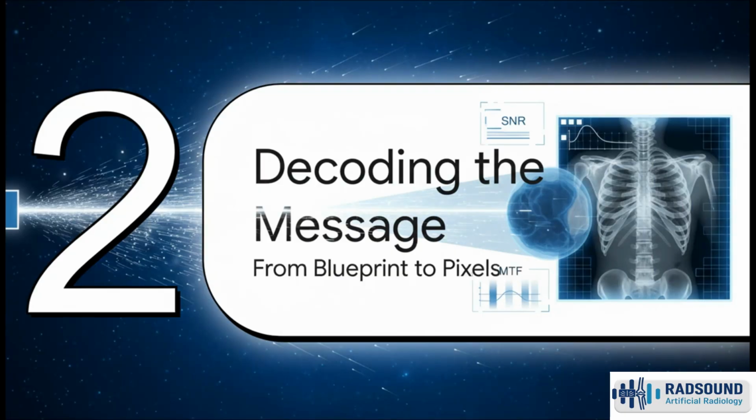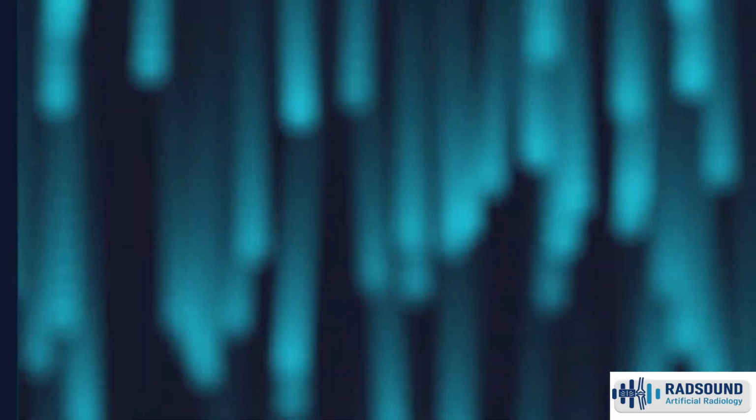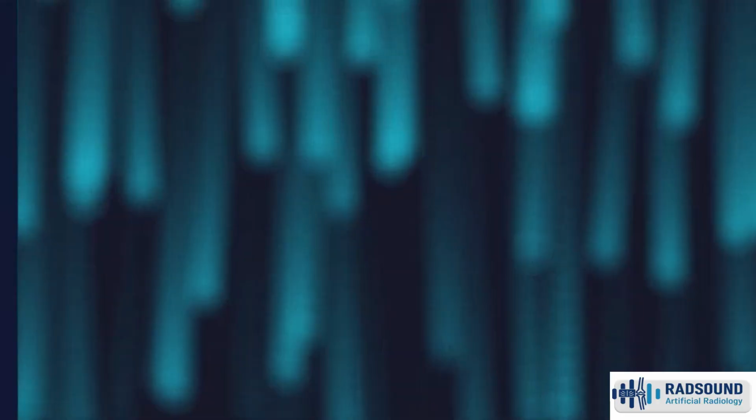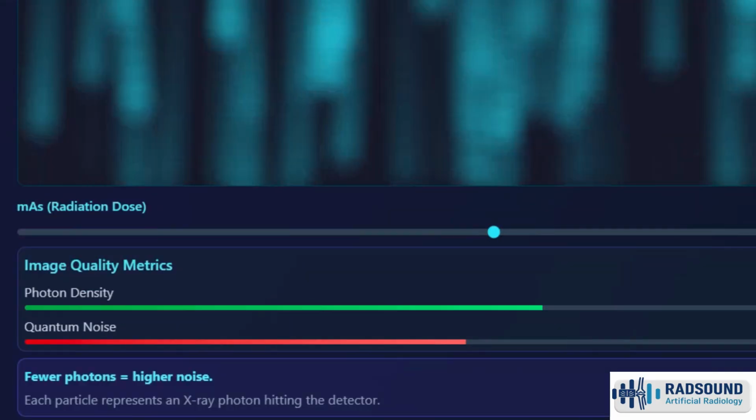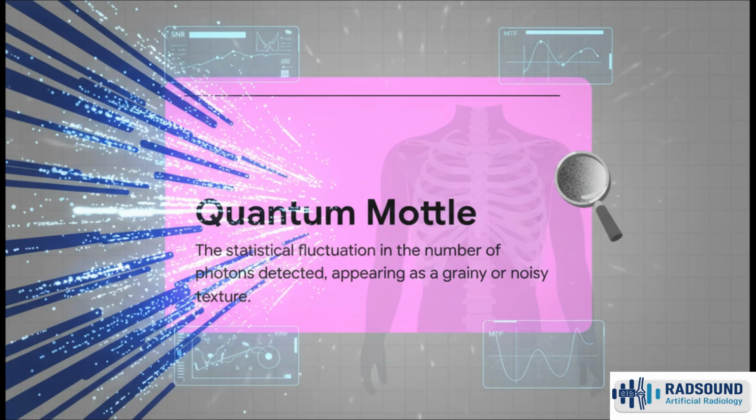All right, so we've got our invisible message, the remnant beam. Now what? The next big challenge is to actually capture that message and translate it into something we can see, a visible image made up of pixels on a screen. Now, there's another kind of noise we have to deal with, and it's called quantum mottle. Because photons are these tiny individual particles that arrive at the detector in a totally random pattern. If you don't use enough of them, the image looks grainy and noisy. It's just a statistical thing.